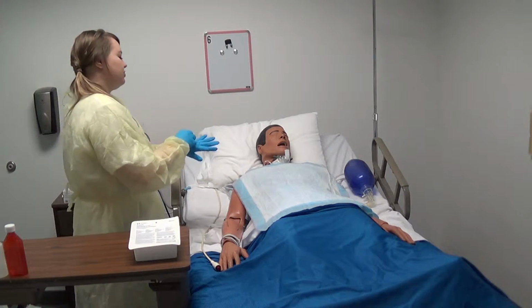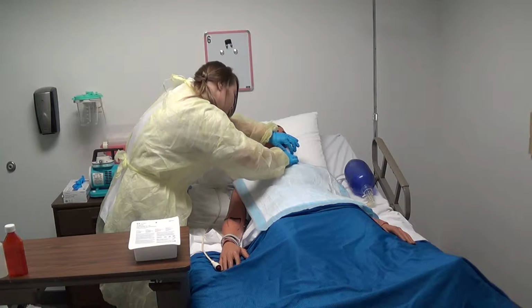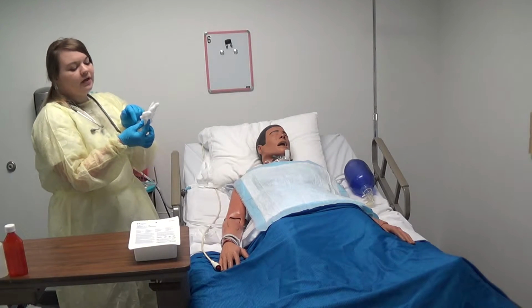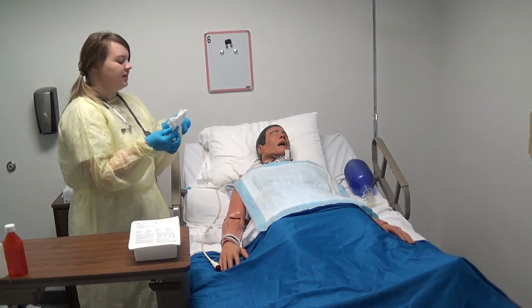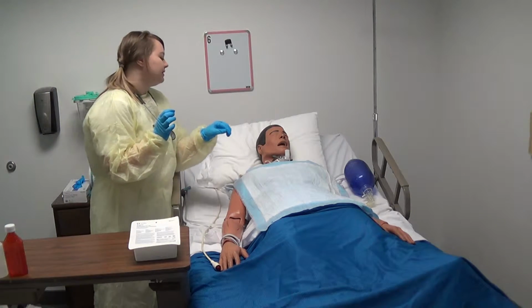And remove my dressing. I'm going to look at the dressing and look at color, odor, amount, and type, and I would document that in my documentation when I'm done with the procedure. Now I'm ready to begin.